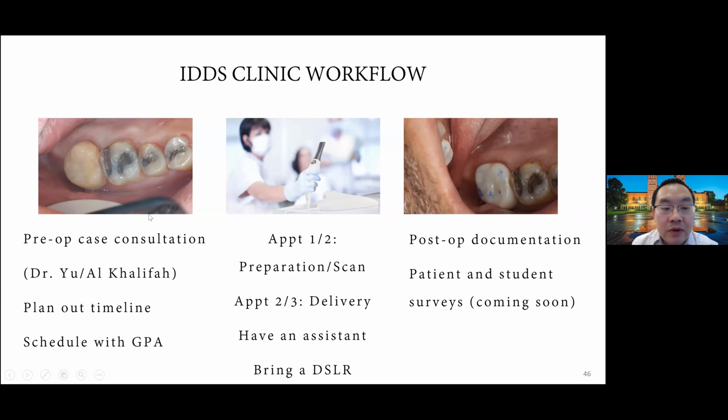We're going to do a pre-op case evaluation. We're going to need some information based on the intraoral photos of the patient. We need to see the patient's cast. You're going to need that no matter what, whether you're doing a conventional workflow or the digital workflow. You need to have your cast, you need to have your stents and everything ready. So show us a cast or a photo of the cast. Have a little consultation with me or Dr. Khalifa. Usually those go fairly fast.